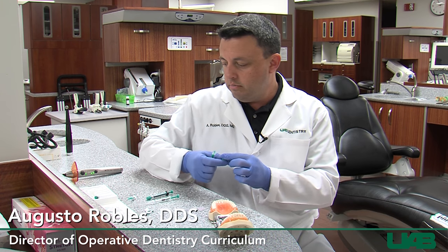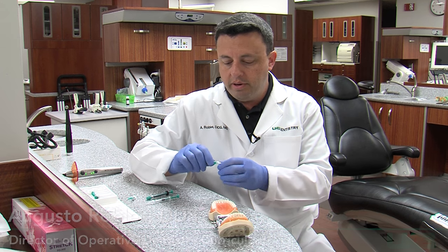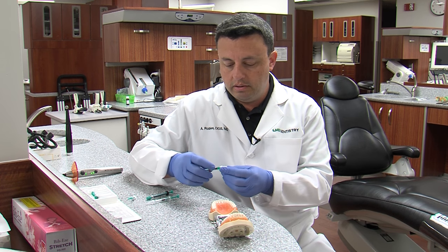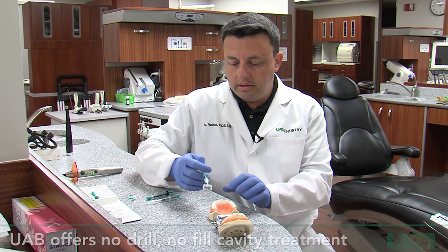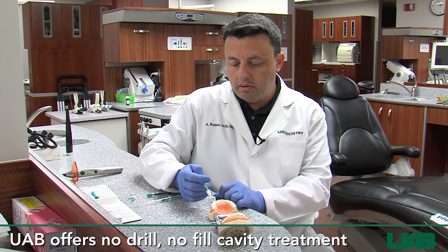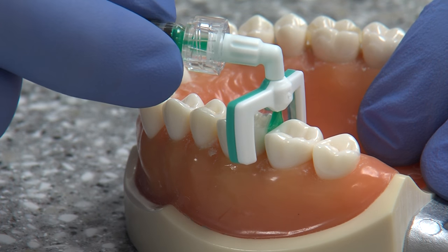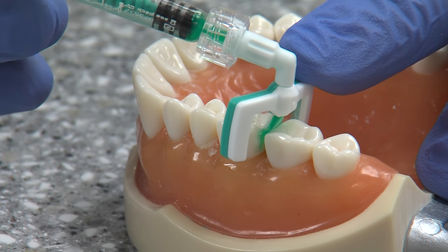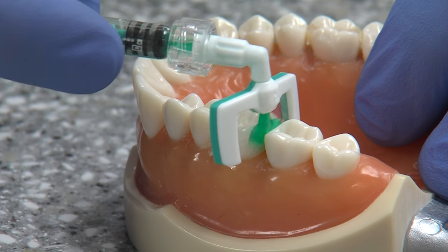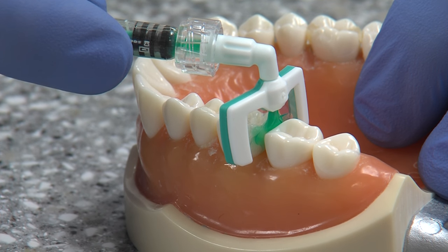The process starts with a little gel — a solution designed to prepare the surface to receive the resin. It has a cellophane-type separator or applicator that can be slid between teeth so that it reaches the affected surface. By extruding this, we can get the gel to go in between teeth, and it will only go to the tooth affected.